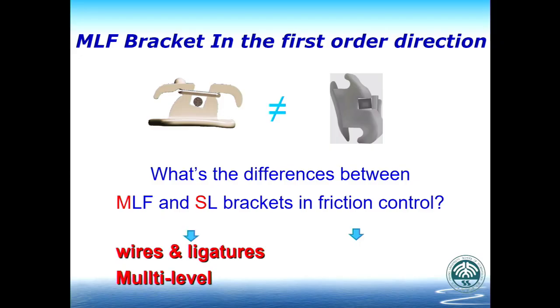So we can adjust the friction by changing the archwire or changing the way we ligate it. So we can have multi-level friction.